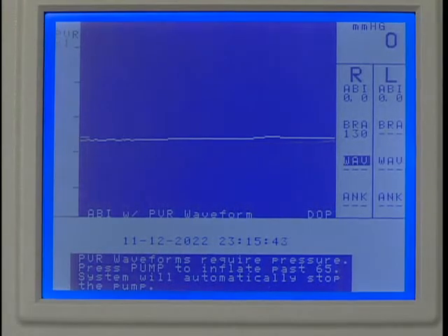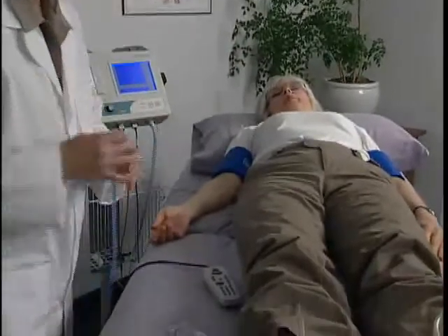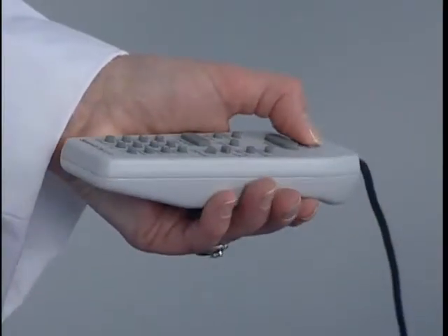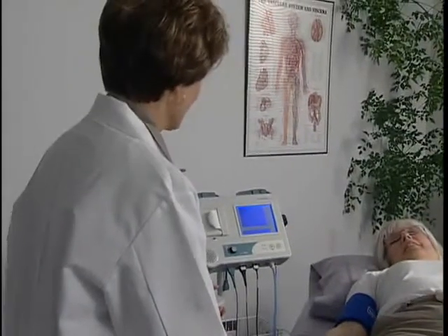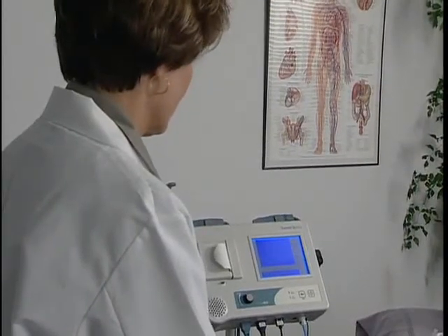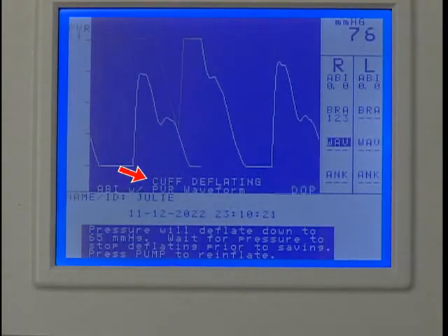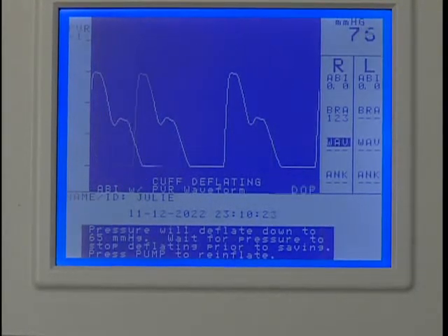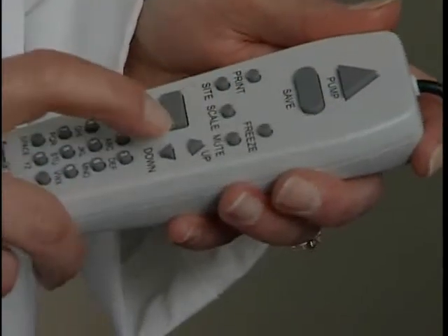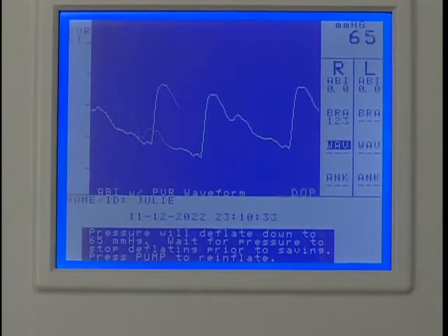Now we'll obtain the ankle waveform using PVR. Move the hose to the right ankle and connect it to the cuff. Press and hold pump to inflate the cuff to 75 millimeters of mercury, then release when the inflation automatically stops. Pressure will deflate to 65 millimeters of mercury for optimum PVR. Wait for the cuff deflating message on the display to disappear. If needed, use the scale key to optimize the waveform.